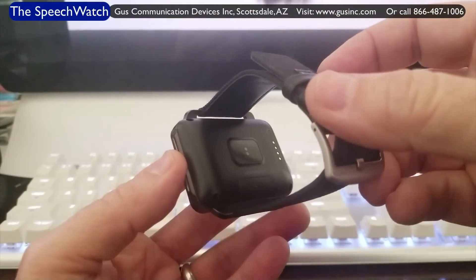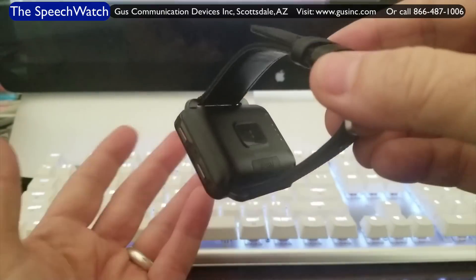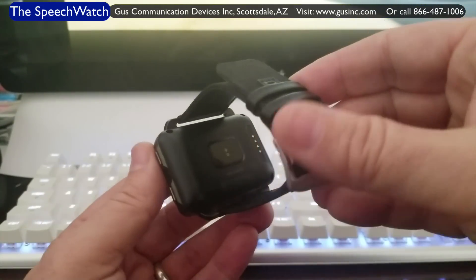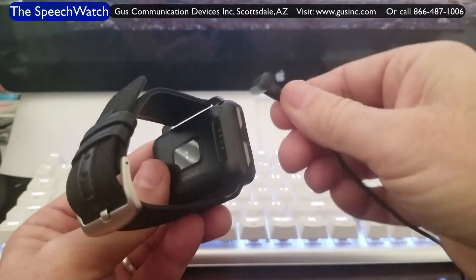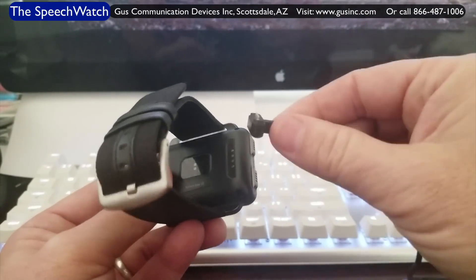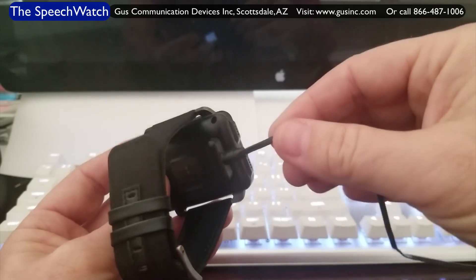It even has Google Voice — you can speak to it and it'll take commands, like OK Google, and it'll do whatever you want. This is where the charger connects. It connects to a USB port and has a little magnetic function. Touch it on there, charge up for an hour and a half, and you're good to go.